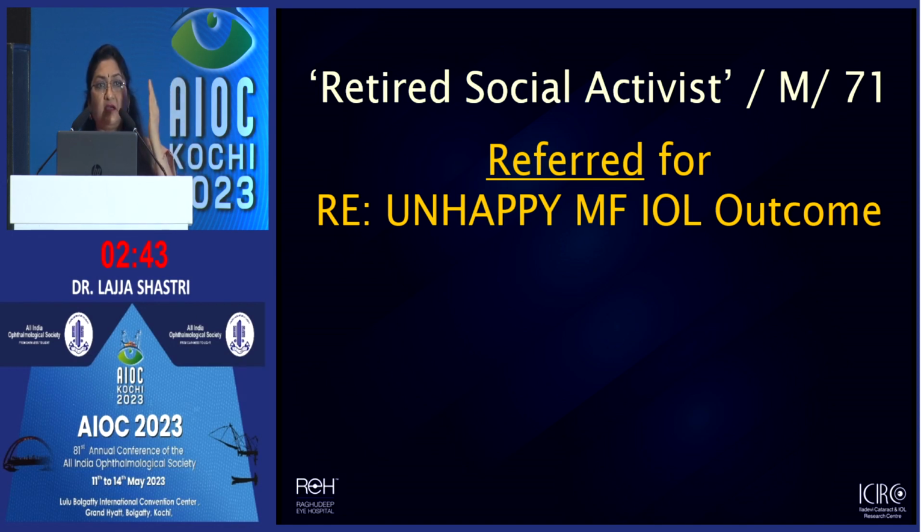Now, since he unfortunately chose to come to us, the operating surgeon called us and gave us a bit of information on why this patient is coming to us, and told us that the surgery was fine, the lens is fine, there is no significant residual refractive error. I don't know why this patient is so bitter and unhappy with us.